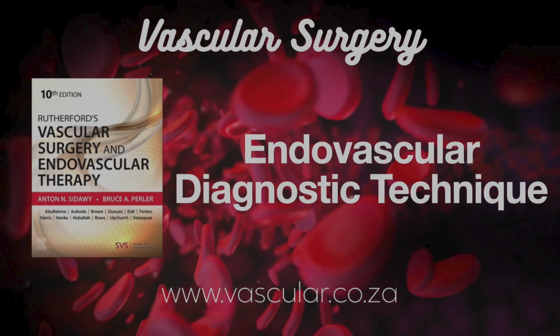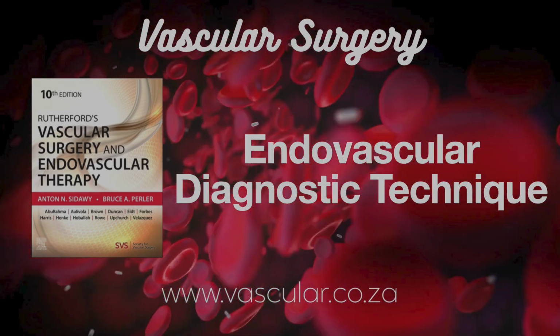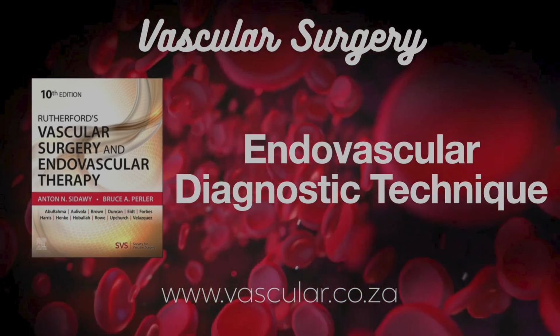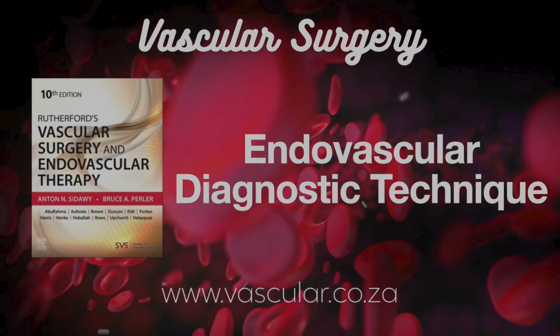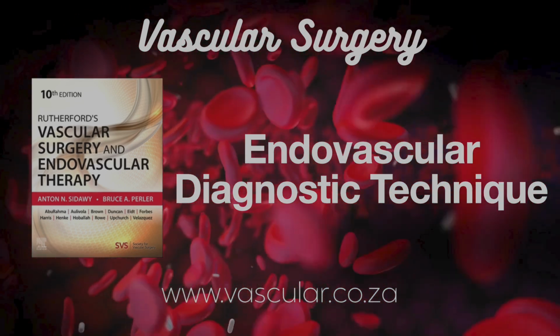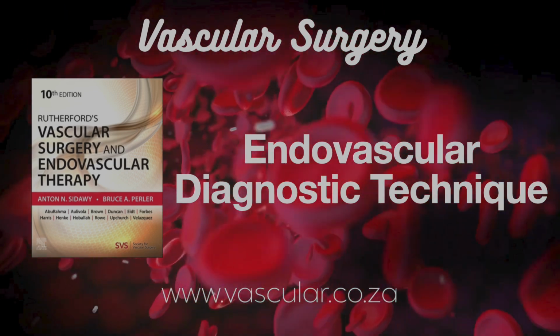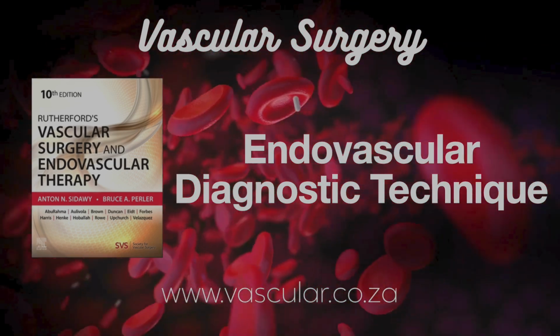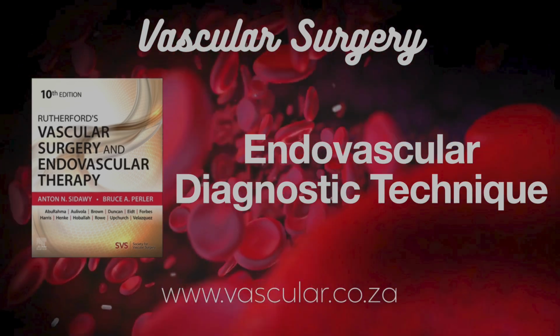Often use the tip of a pigtail or Omni Flush catheter, point it towards the opposite iliac, advance a wire down that side, then push the catheter over the wire into the external iliac or a CFA. Or use other shaped selective catheters. Then you image that leg specifically. Right. Position the catheter, then do multiple DSA runs, usually injecting contrast by hand at different levels, thigh, knee, calf, foot, to see each segment clearly.